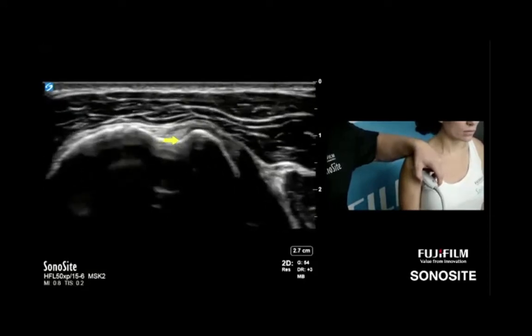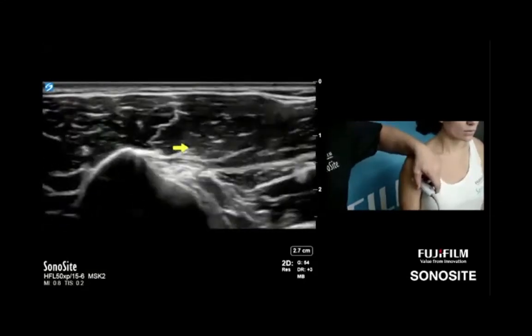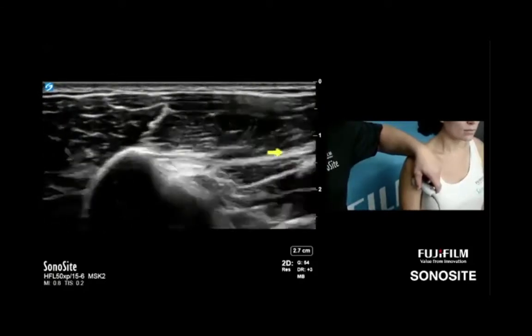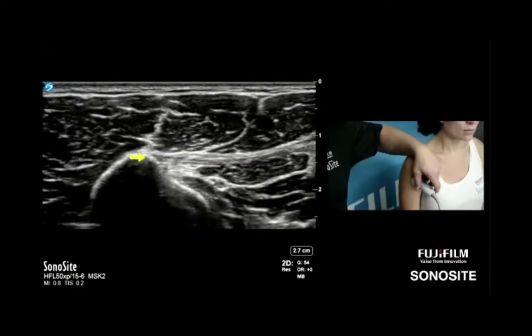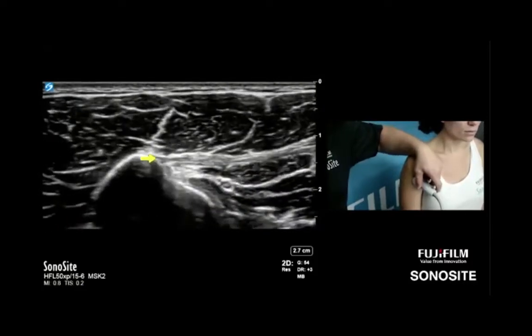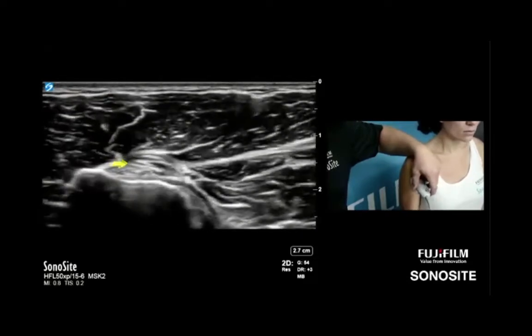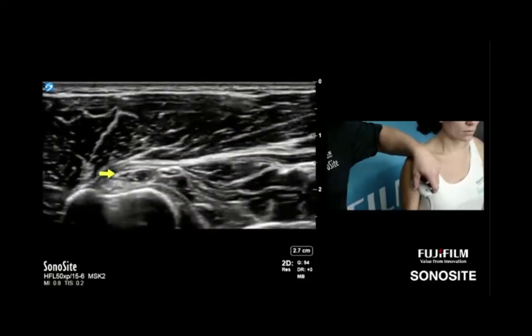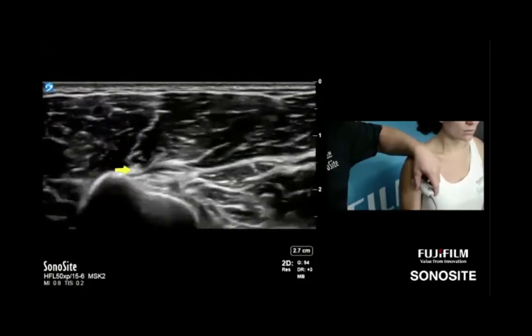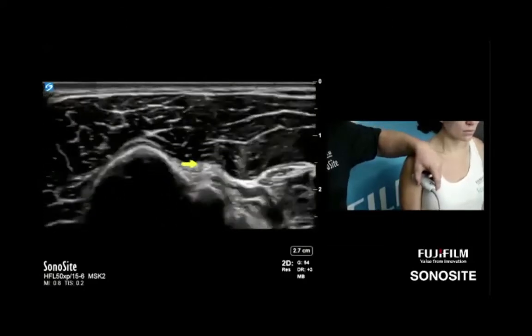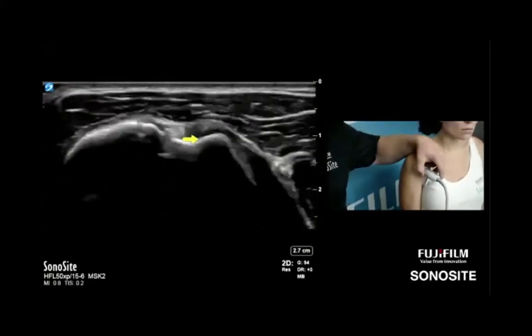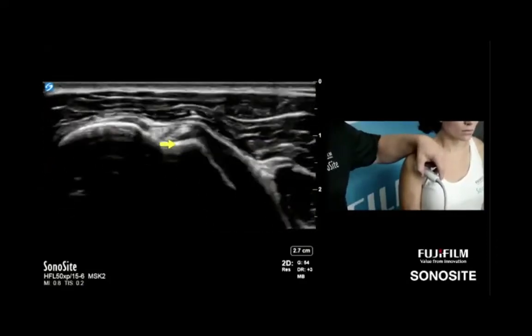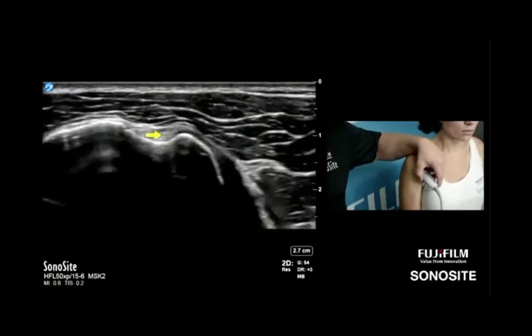Scanning more distally down to the pectoralis, as Bill mentioned, we should see this nice horizontal fibrillar striated structure coming in from medial to lateral, inserting on that ridge on the humerus. Having Jamie slowly externally rotate, we watch the pectoralis stretch out, and we can still see the bicipital tendon right underneath it. I've scanned enough in transverse for the more prominent pathology — I don't really need to go further than the pectoralis unless clinically indicated.